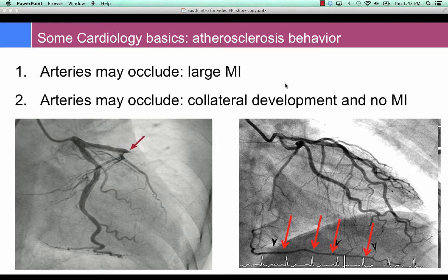And this image on the lower right demonstrates a person who's had the right coronary artery completely occluded, but all the distal ramifications of the right coronary artery have been supported, and you can see on a direct injection of the left coronary artery that collaterals are illuminating the very large posterior descending arteries. So we have left to right collaterals, which are also very common. And now with improved spatial resolution, we can often see these, and we'll demonstrate cases of this for you at the course.